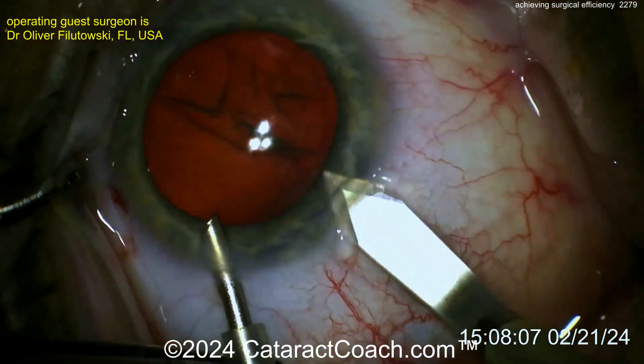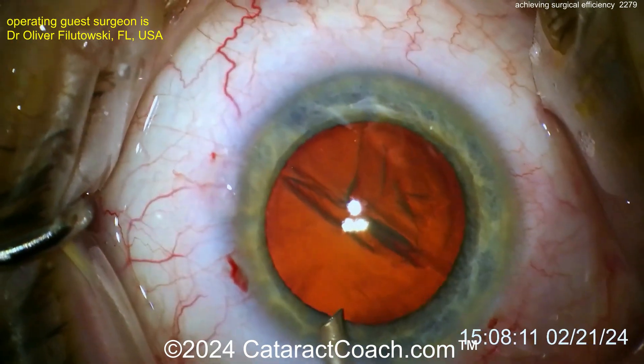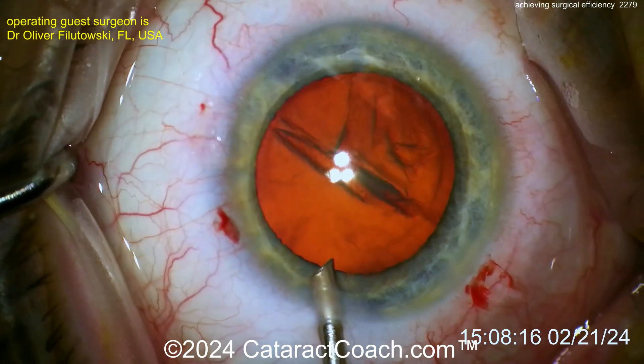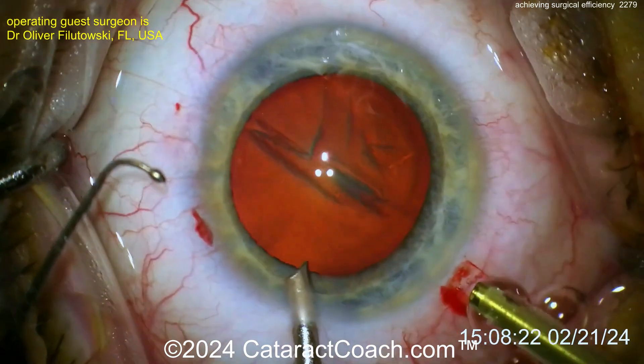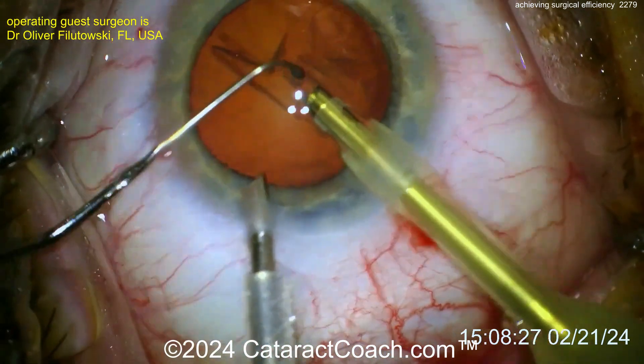Here comes the main incision — now enlarging one of those paras into the main incision. Now let's see the phaco technique here. To be an efficient surgeon, you can do divide and conquer, stop and chop — it's all good, you should learn all the techniques. But really for efficiency, you want to do a technique that's going to be a lot faster for nucleus disassembly, like chop.